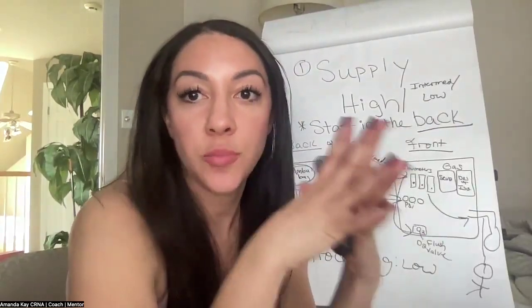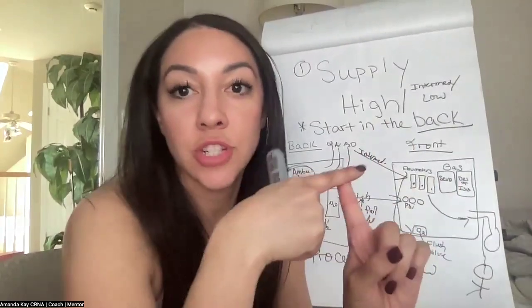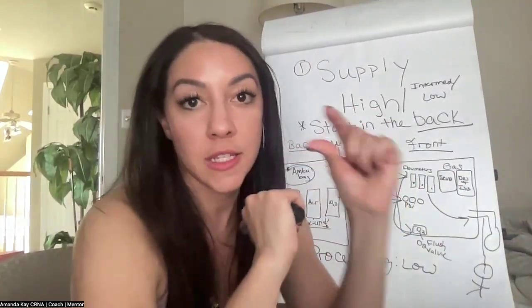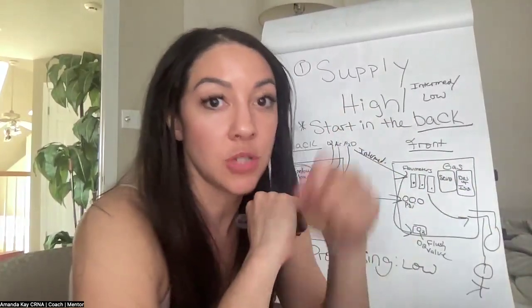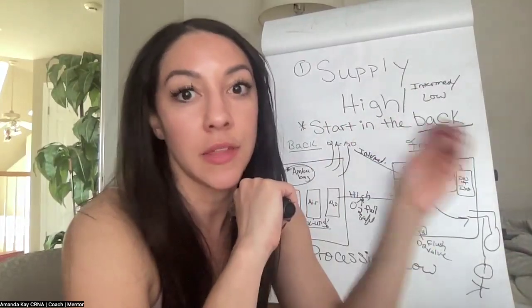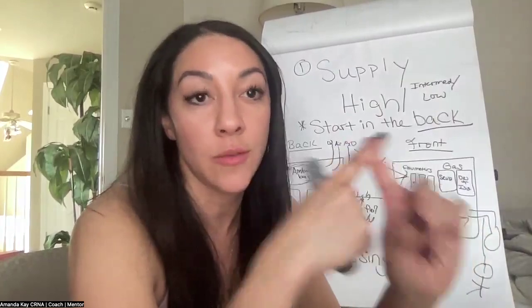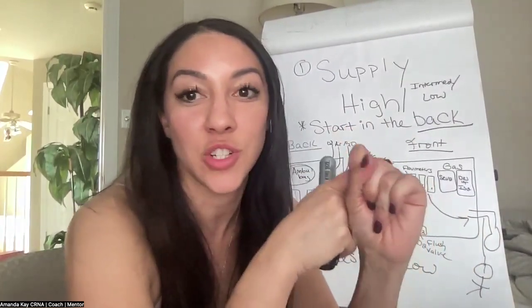Other parts of this low pressure system when we're talking about processing is your oxygen concentration analyzer. It's different in every machine, but on a lot of machines we always had to check those and make sure they weren't loose. Sometimes you pull it off, put it to air, and then plug it back in and see. But you always want to make sure the oxygen concentration analyzer is reading correctly, so we know how much oxygen concentration we're giving.